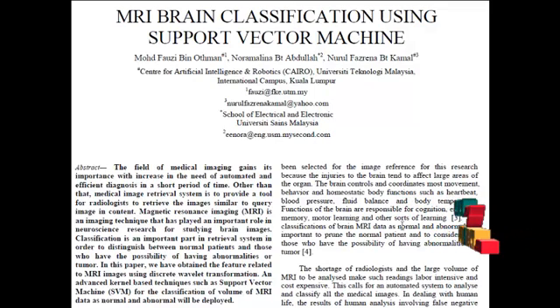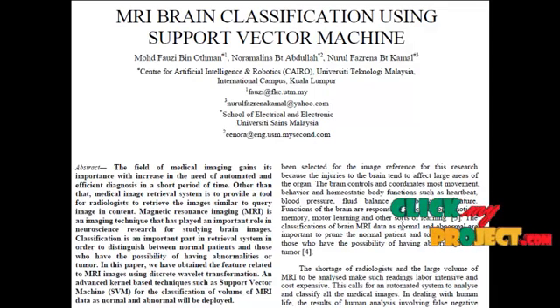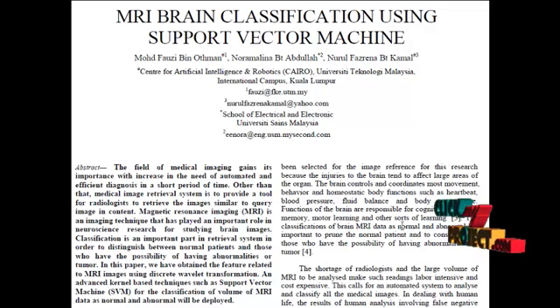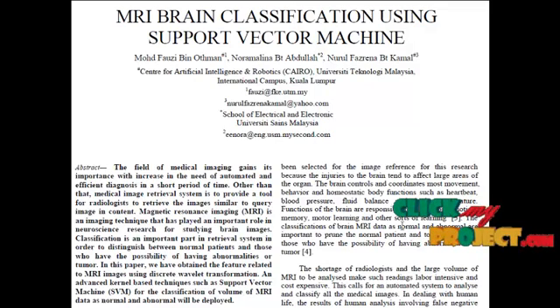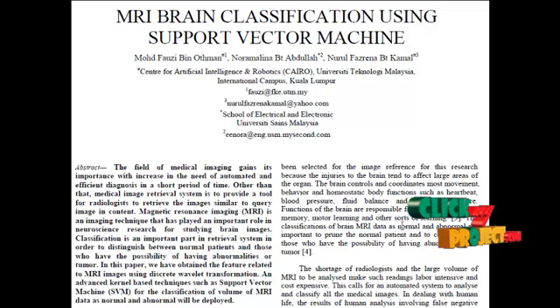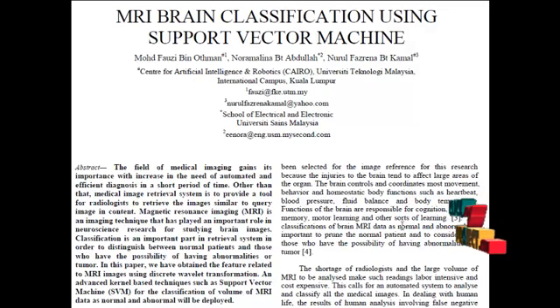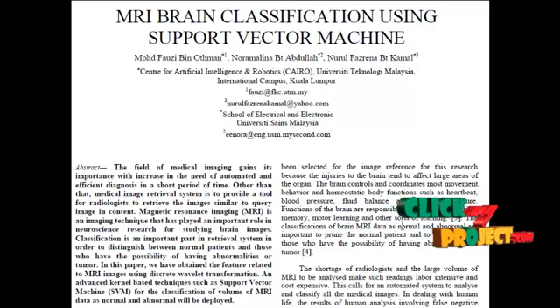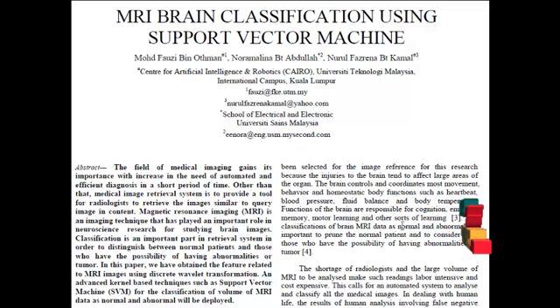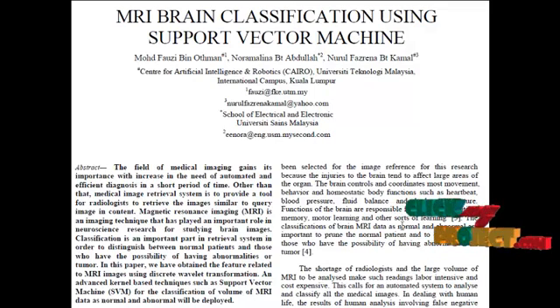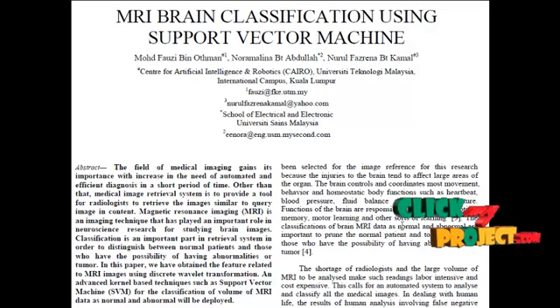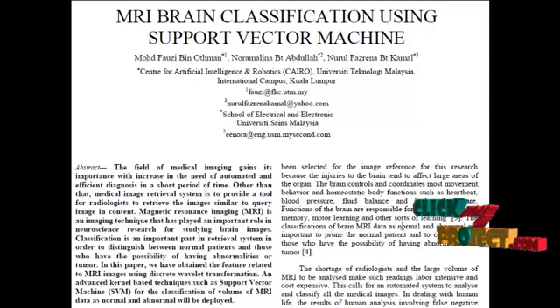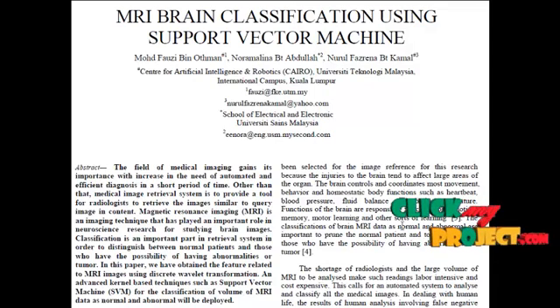For feature extraction, we will introduce the gray level co-occurrence matrix system. After constructing the co-occurrence matrix with the help of statistical measures such as correlation, contrast, energy, entropy, etc., we may extract the features and segment the given brain image for the identification of tumor also. This system will be useful in future as part of a content-based medical image retrieval system.